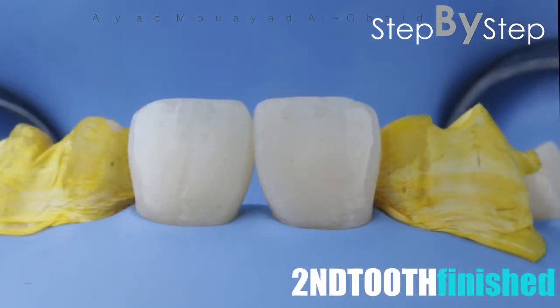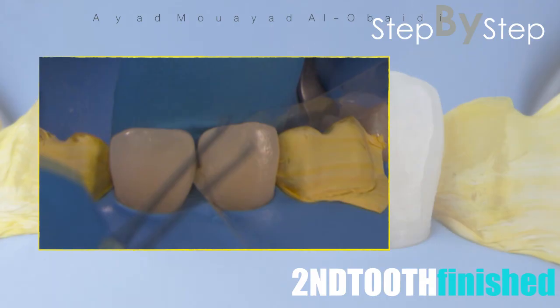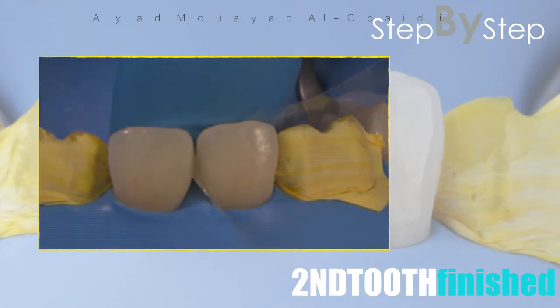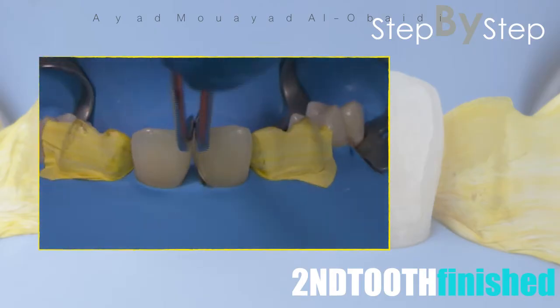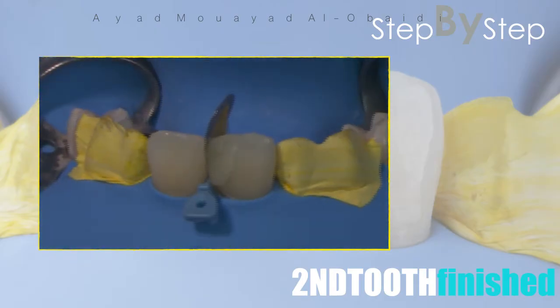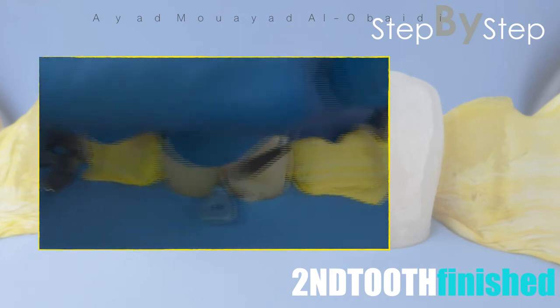This is the final situation. I will show you in this short video how to perform the emergence profile of the second tooth using the same technique, and then we use the sectional matrix to perform the proximal contact and contour of the second tooth using body shade composite.